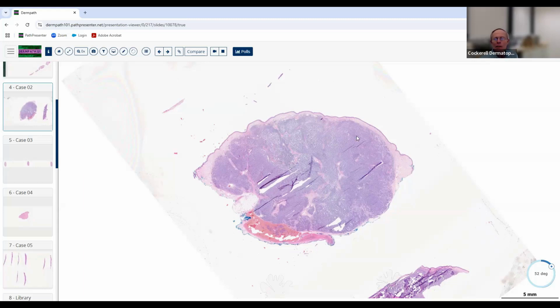And so you ask yourself, well, is this benign or malignant? Well, it's pretty big. So right off the bat, that favors malignant. It doesn't have to be, but it tends to favor it, as opposed to the last, which was very, very small. If you draw a line down the middle of it, it's not really very symmetrical. You've got this large aggregation over here where these cells have coalesced, and smaller areas over here, these small little nodular aggregations. So this doesn't look exactly the same on one side or the other. But then you say, well, what about circumscription? Well, it's not too poorly circumscribed. You can kind of draw a line around the whole thing.